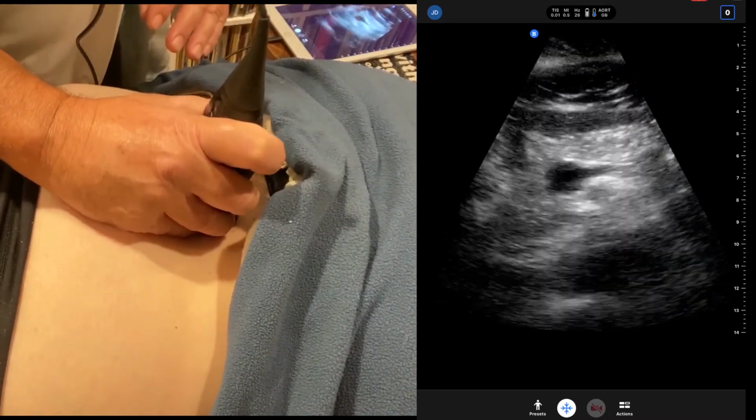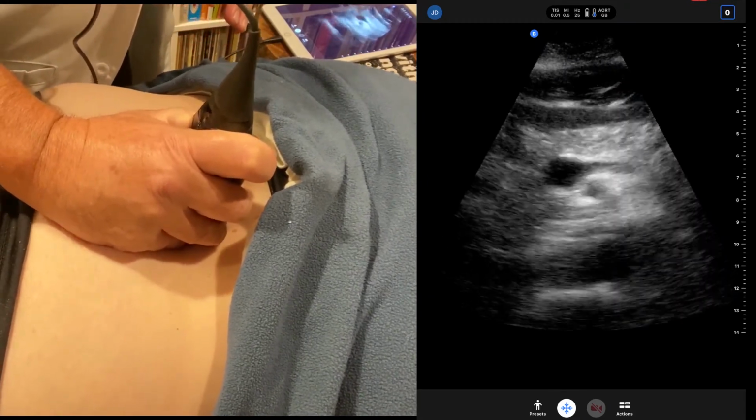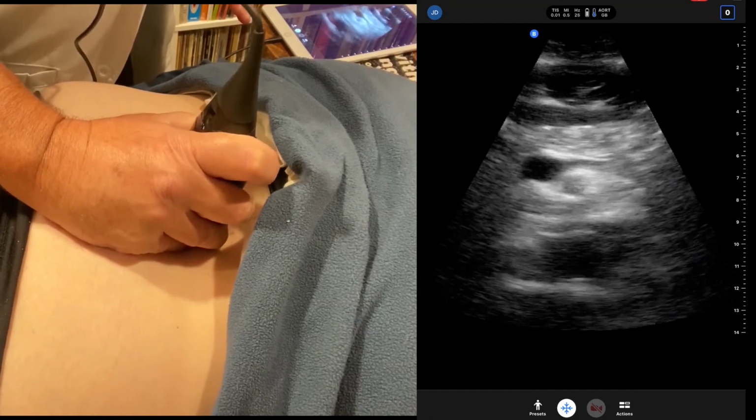And then we would go on down and continue our evaluation of the aorta. There's the superior mesenteric artery, spinal process, spine shadow, and there's our aorta.